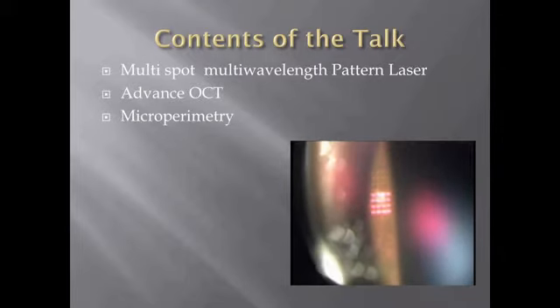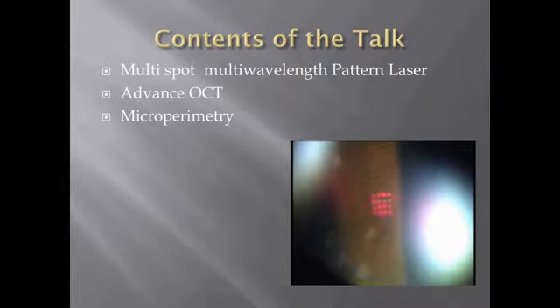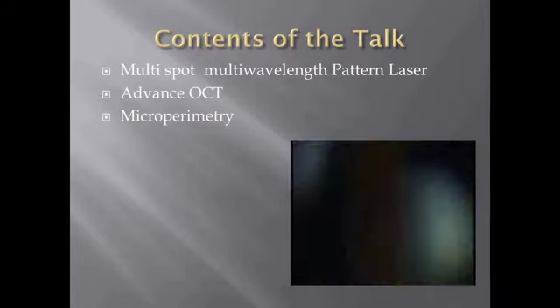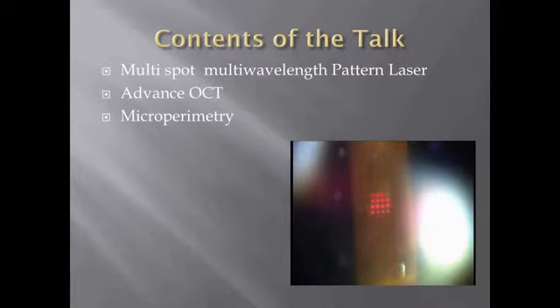So we've been using the multi-spot laser for a while now, and originally the Pascal came in, and that's what changed the way we were looking at a single-spot laser. We were used to lasering in a certain way, and then suddenly all that changed with how we started handling the multi-spot laser. And now we have different options to do that.